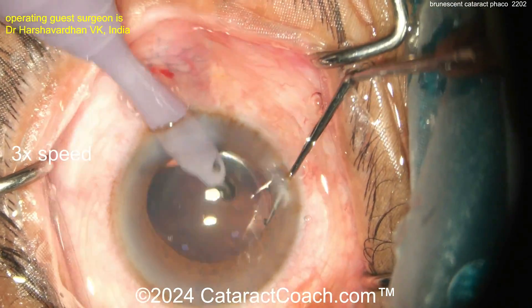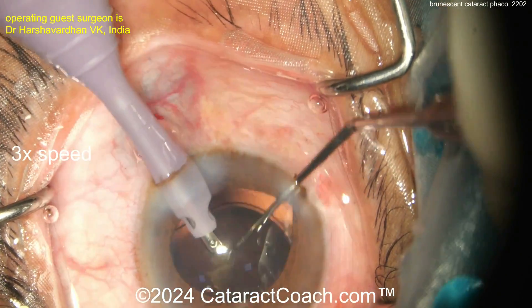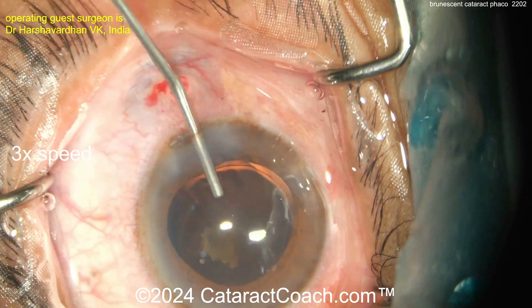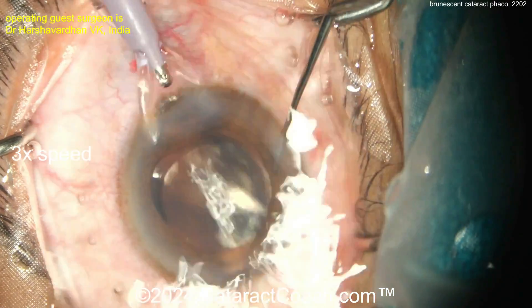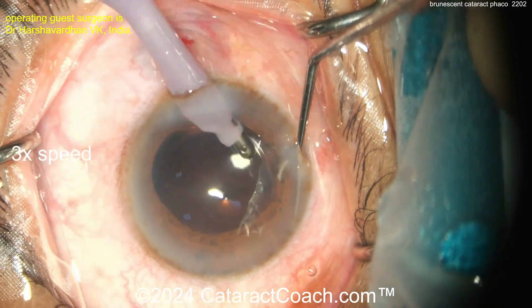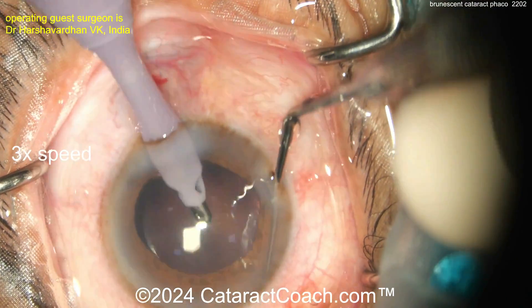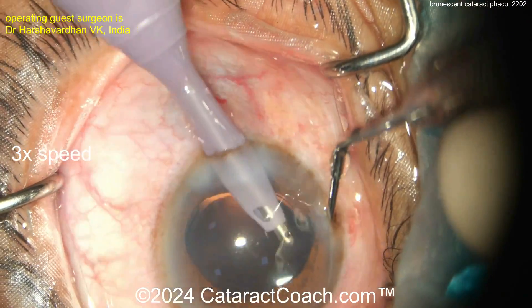You can definitely do brunescent cataracts and have a beautiful outcome, but it's a lot more challenging. For a beginning surgeon, this is a tough case. Wait — what's that? Is that iris tissue or a nuclear chunk left over? The phaco probe is going back in to get that last nuclear chunk, which may have been hidden under the subincisional iris — possibly contributing to the iris prolapse. You don't want to leave a big chunk like that; it's never going to dissolve — it's a rock. So glad the surgeon went back with the phaco probe.